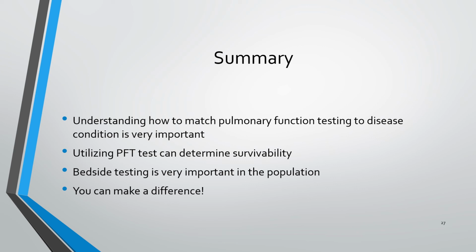We really need to apply everything we know so that they understand what's going on and how the disease is progressing. Many studies are out there showing that if you do different types of spirometry tests and MIPs and MEPs, you could determine survivability, which is really kind of relative. People want to know how long they're going to survive, and also when you need to have an intervention such as non-invasive ventilation, because a significant part of this population ends up on non-invasive ventilation.